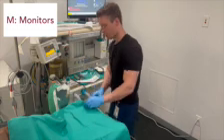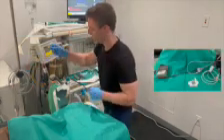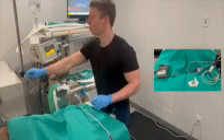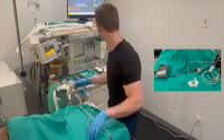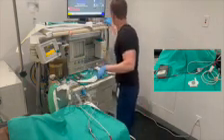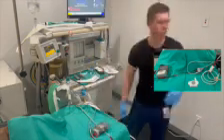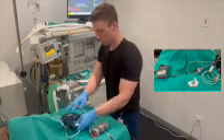The next M stands for monitors. For any general anesthetic, ASA standards dictate that a pulse oximeter, blood pressure cuff, EKG leads, temperature probe, and nerve stimulator must be utilized in order for a safe anesthetic to occur. Ensure that these devices are all functioning properly and organized in a way to where they can be accessed easily once the patient is in the room.